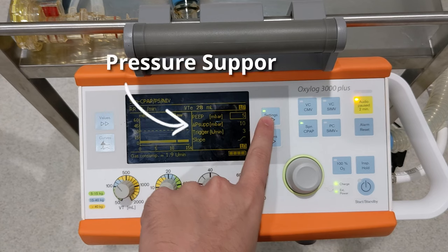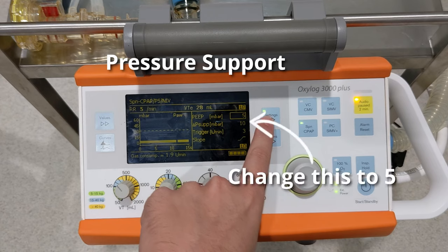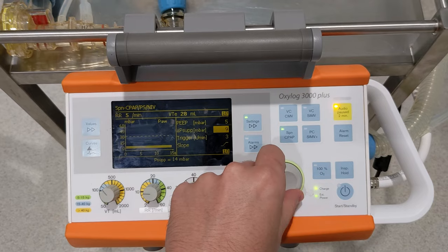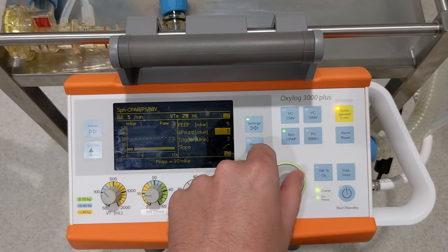We're going to be changing our PSUP, which is pressure support. This is how much extra pressure the patient will be given on inspiration, above the PEEP level that we've set. Generally, starting at 5 is fine, but you might need to adjust it according to the patient. To change it, select it with the rotary knob, change it to your desired level, and then press down to confirm.